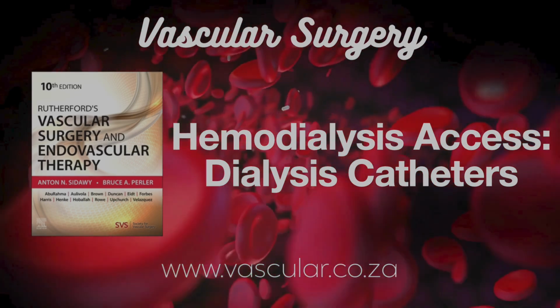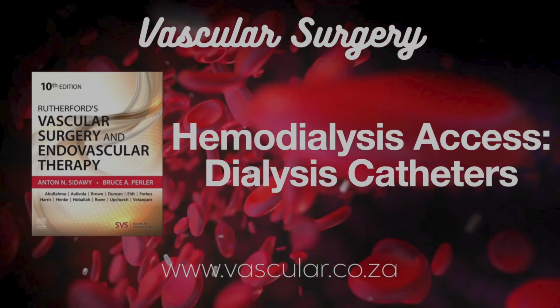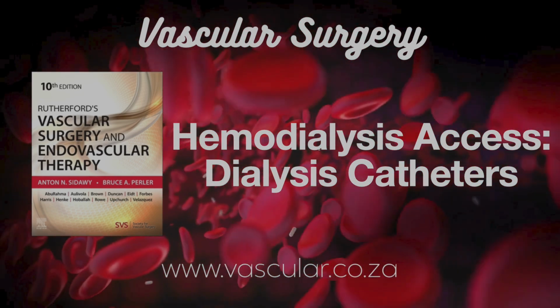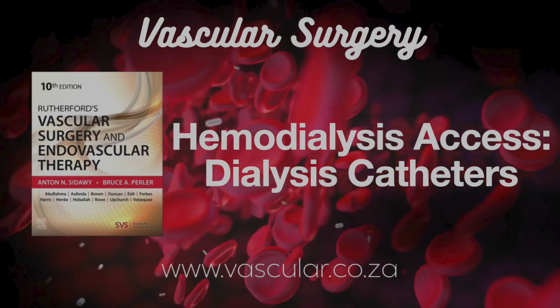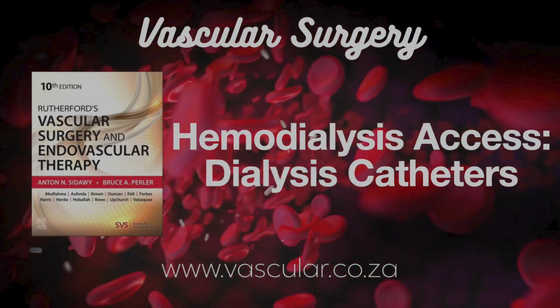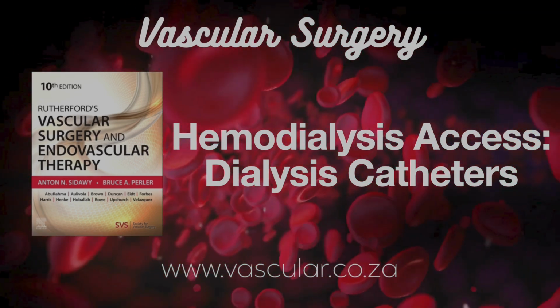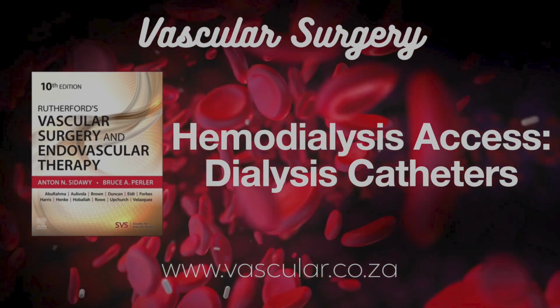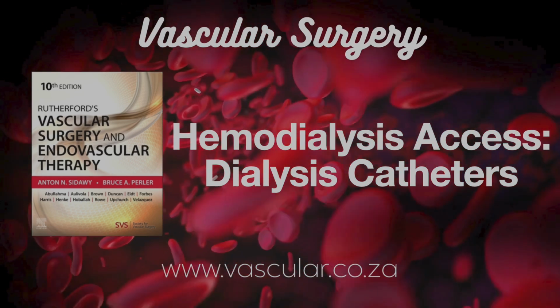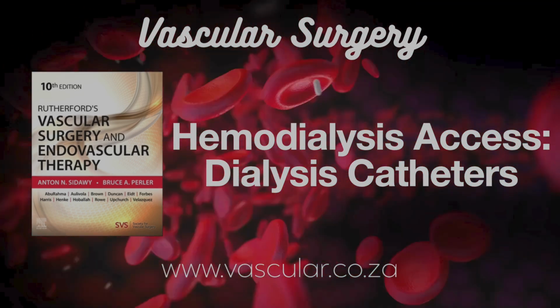Good to know. Other imaging options? Computed tomographic venography, or CTV, that's another cross-sectional imaging technique. Advantages of CTV: it's often widely available, it's fast, and there are generally fewer concerns about the contrast agent compared to gadolinium, though contrast is still used. It gives excellent views, especially of the superior vena cava, and studies show it matches up well with the gold standard for finding central blockages.